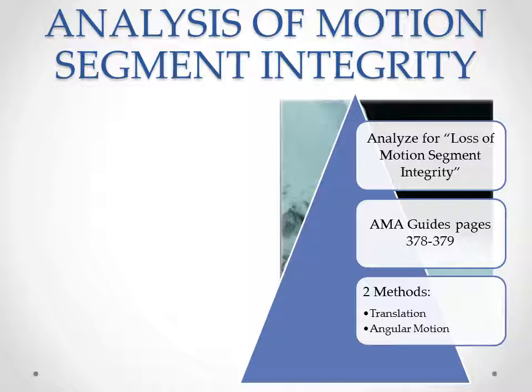For those of you that have the PowerPoint presentation, you will be able to watch along as I go through this. Those of you that are simply listening to this on audio program are going to miss the step-by-step procedures whereby motion segment integrity is analyzed, but you'll at least hear my narration here on the audio portion of the program, and I encourage you to go back and look at the PowerPoint presentation so that you will have the materials that you need to do an analysis of motion segment integrity on your very next case.